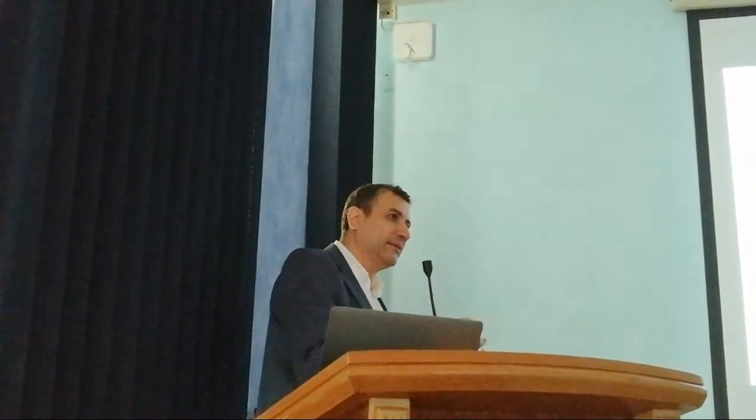When you have postnatal transition, I really worry about pneumothorax. Even for this case, a lot of the audience recognize that we could go to 10, 11, and 13. No, RDS is different. More than 7 or 8 is not accepted. 8 is a maximum during transition because pneumothorax is really expected, and we have to consider surfactant even more than 1 dose. But this infant with chronic lung disease, the pneumothorax is unlikely.